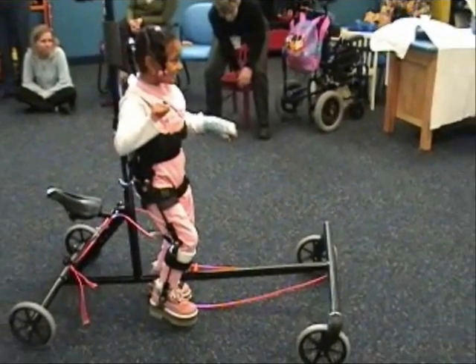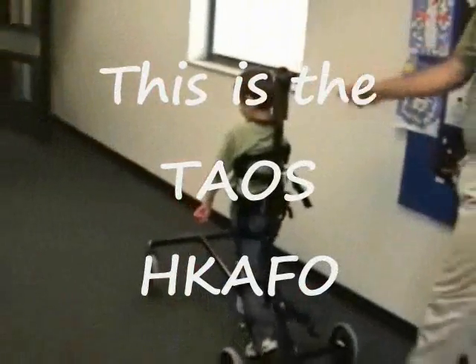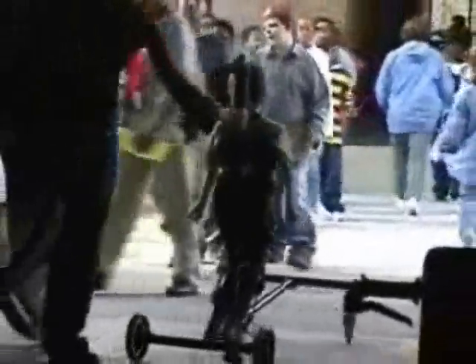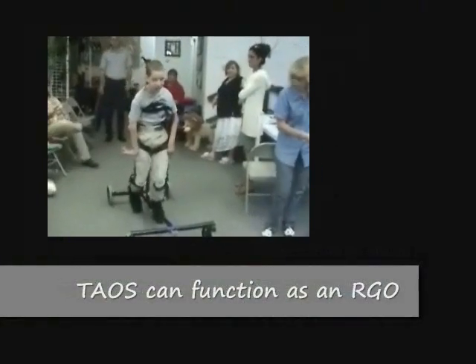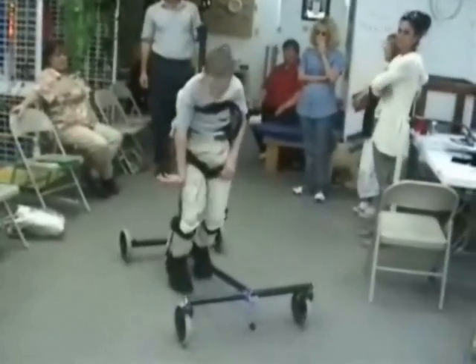This particular device is called the TAOS HKAFO system. These kids look really good and in some cases they really just take off. Here you can see it being used in a school setting. We are stabilizing the lower extremity while allowing the upper extremity to be free. This patient is going to show us how it can be used as a reciprocal gait orthosis.